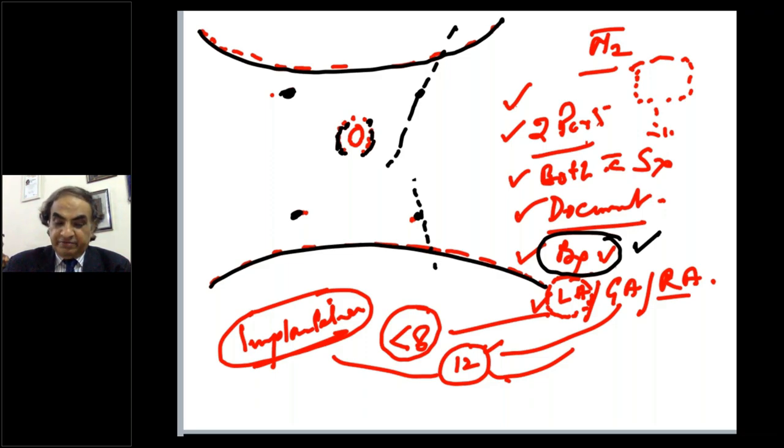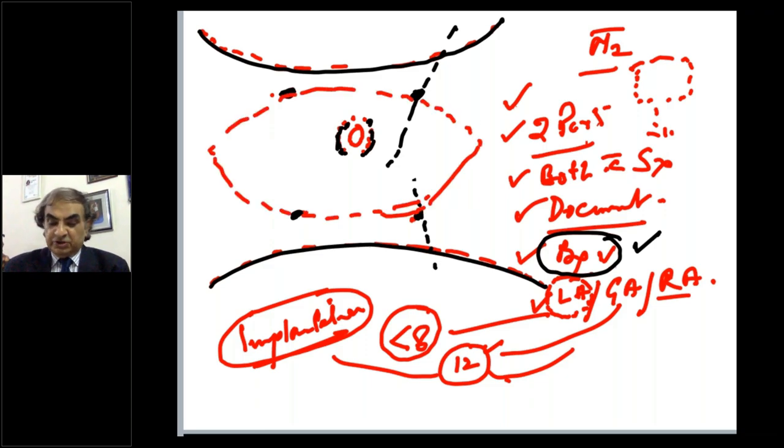Otherwise, when you eventually have to plan more ports, I don't need to tell you about the concept of a baseball which forms like this. If you have this concept in mind, all ports should figure in. And a lot of people follow the rule of 60 degree. All that is a general laparoscopy. Now I'm talking about diagnostic laparoscopy as a routine.